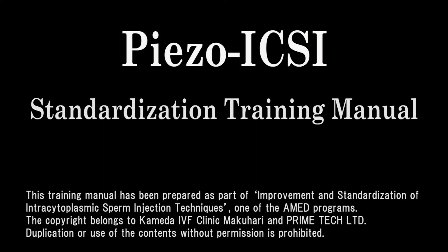This training manual introduces the piezo-ICSI technique using a piezo micromanipulator for the improvement and standardization of intracytoplasmic sperm injection techniques. This manual preparation was supported by the Japan Agency for Medical Research and Development Program.